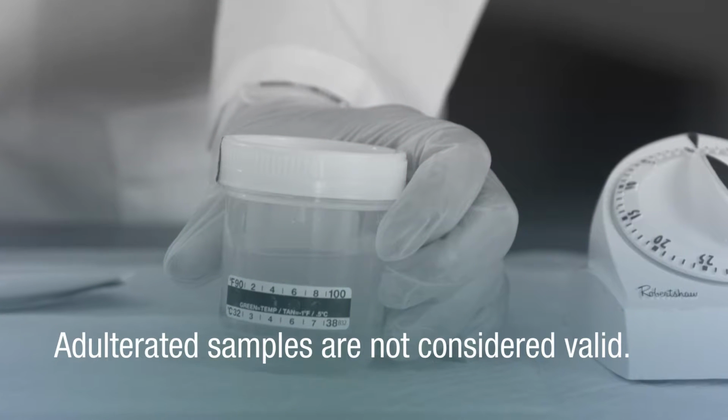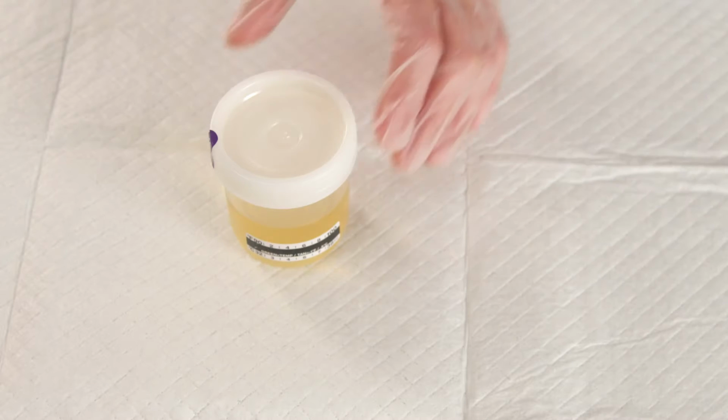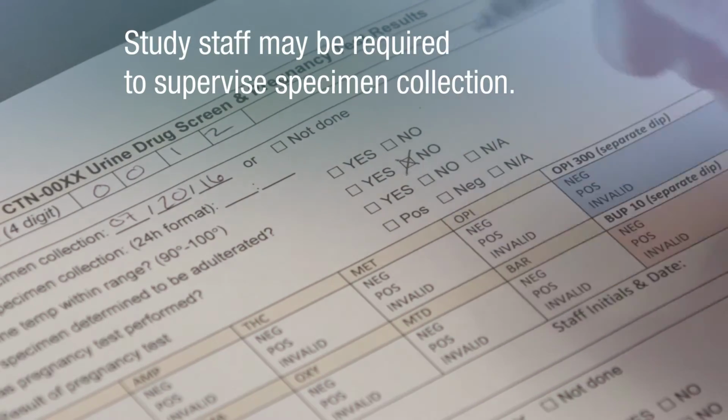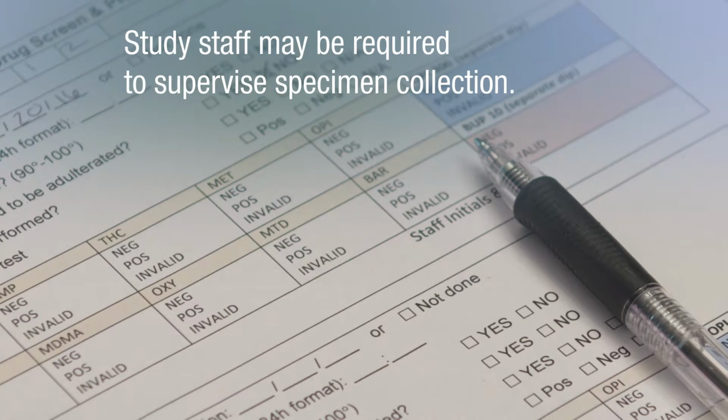Adulterated samples are not considered valid and should not be used any further. Ask the participant to provide another sample. If they are not able to, you can offer them a glass or two of water and wait until they are able to provide another sample. You may need to counsel them on the importance of giving valid samples. Remind participants that they will not be penalized for providing samples that test positive for substances. Repeat the process until a valid urine sample is provided. Study staff may be required to supervise specimen collection in circumstances where validity of urine samples is in question.